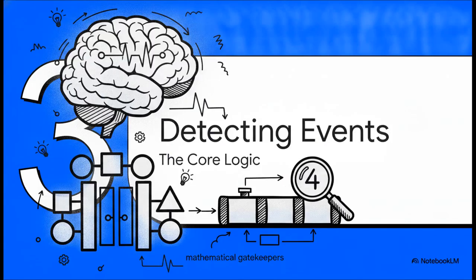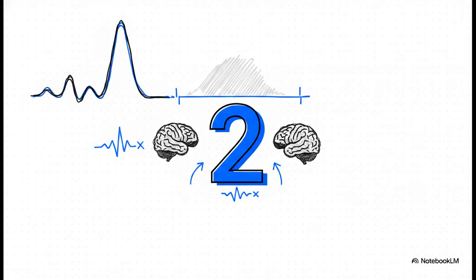All right, part 3, detecting neural events. We're zooming in on step 4 of that pipeline now, because this is where the real analytical heavy lifting happens. Now, what's really interesting about this slide is this single highly important number, 2. Within the algorithm's detection phase, a neural event is only triggered when the z-scored envelope hits 2 or more standard deviations above the baseline. Basically, the software is constantly scanning for significant amplitude excursions in the brainwave. If the neural signal doesn't hit that magic number 2, the algorithm simply ignores it and keeps looking. It is a hard mathematical floor.